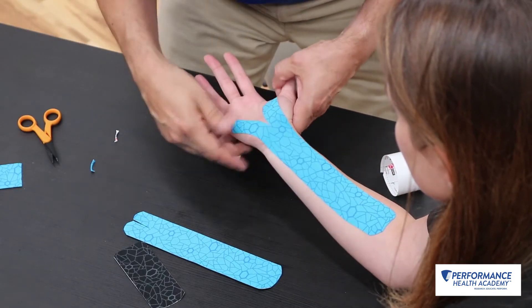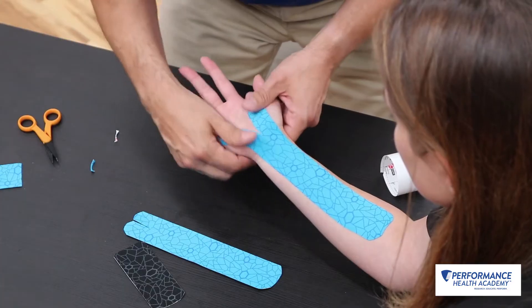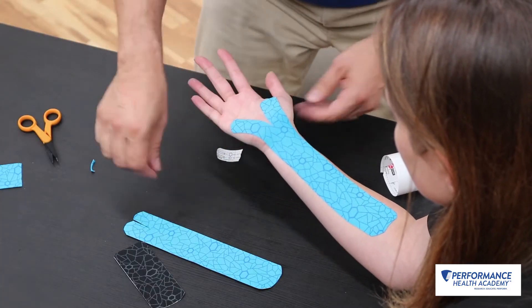Skin preparation is everything with these, and sometimes it's difficult just because of the hand — it's always getting wet.